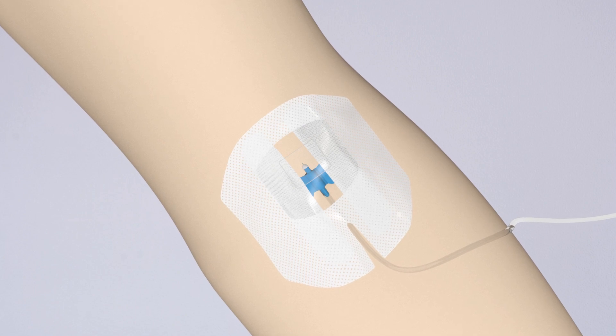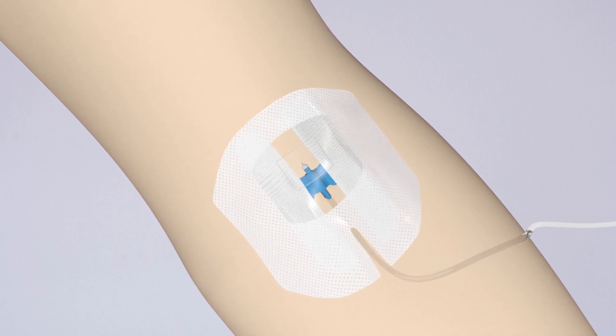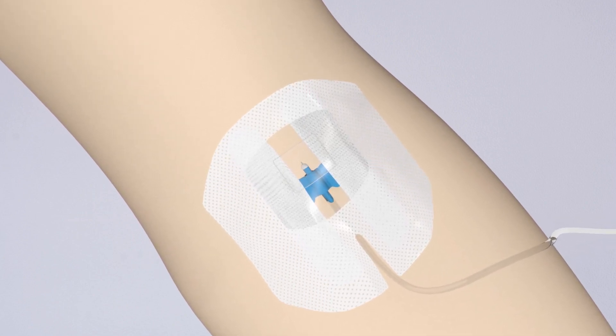AbsoClear IV is clear, transparent hydrogel, which allows easy monitoring of catheter insertion site.